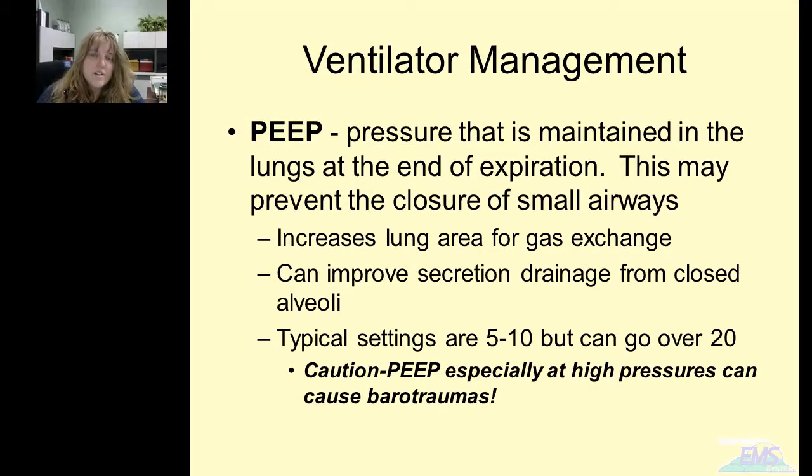One additional area that's important to talk about is PEEP, which stands for positive end expiratory pressure. This is the amount of pressure that's maintained in the lungs at the end of expiration. That's what prevents the lungs from collapsing, those little airways from collapsing entirely. So it increases the lung area for gas exchange and improves secretion drainage from closed alveoli.